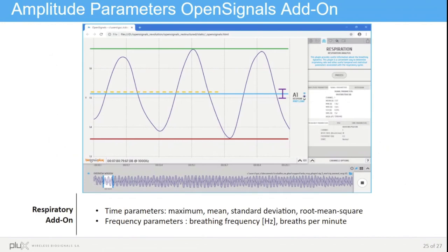Lastly, we'd like to mention the OpenSignals add-on, which allows extraction of all the already discussed features and also some more — for example, amplitude parameters, mean amplitudes, standard deviation of amplitude, the energy of the signal — and also automatically calculates the histogram, some frequency parameters such as power spectral density, and some time parameters, namely beat-to-beat interval features.